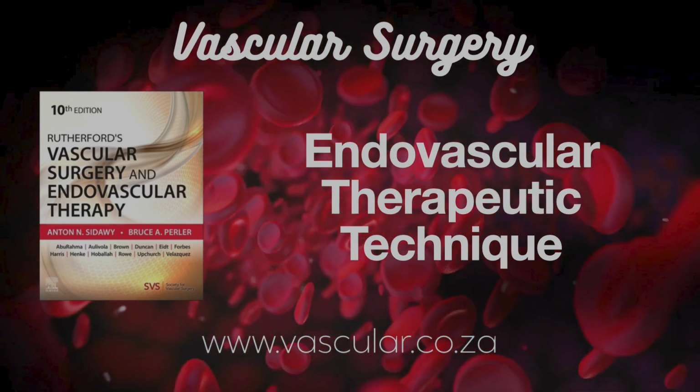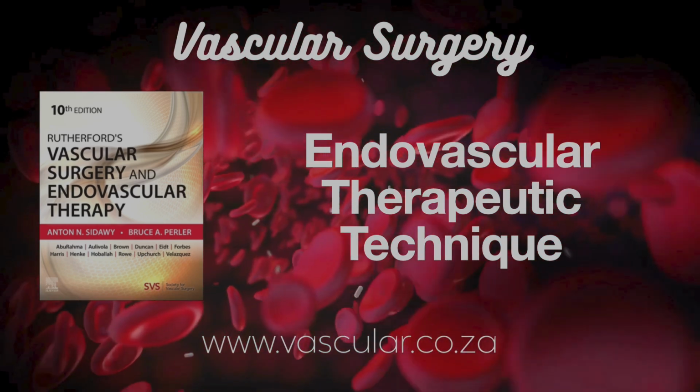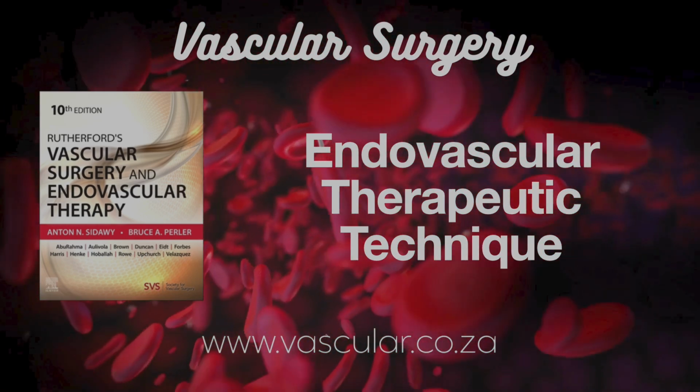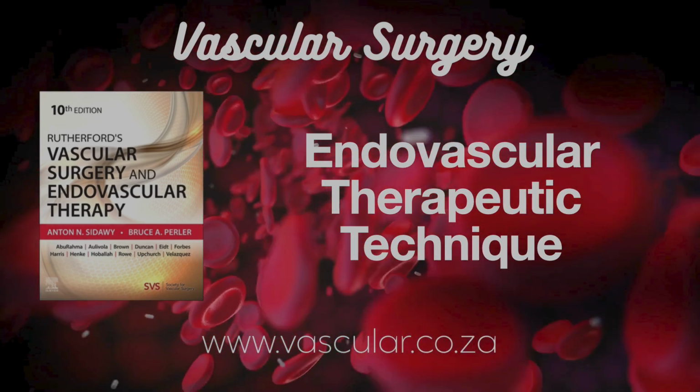Other approaches: bidirectional from above and below via popliteal for tough SFA-BTK CTOs. For gut arteries like celiac and SMA, often coming down from the arm, brachial or radial, works better because of the angle they come off the aorta.